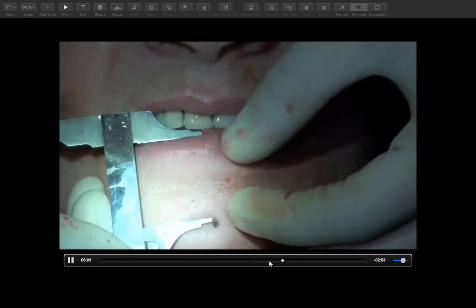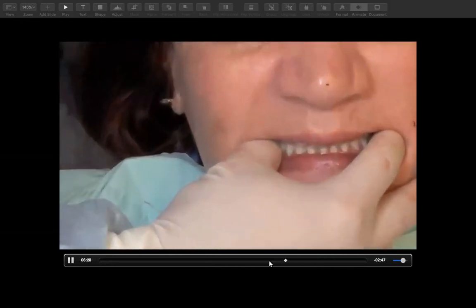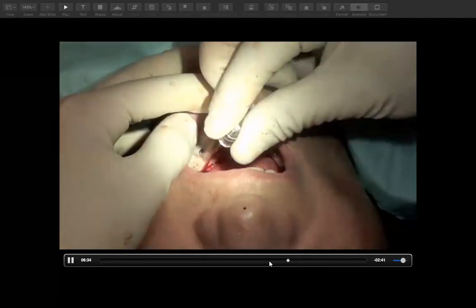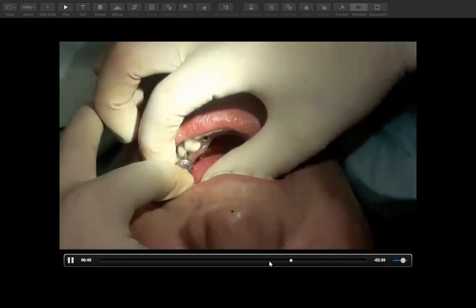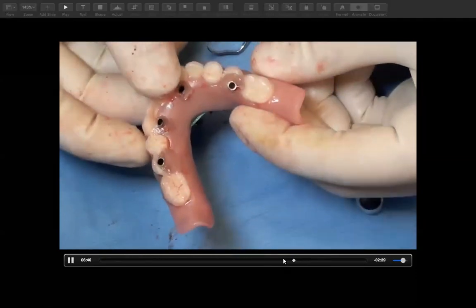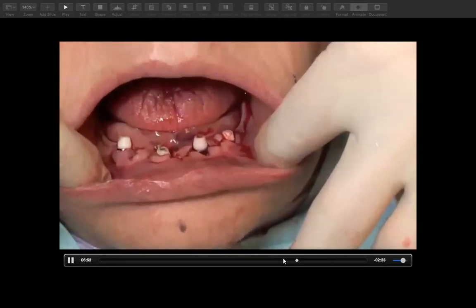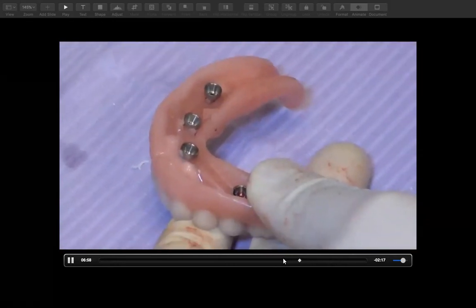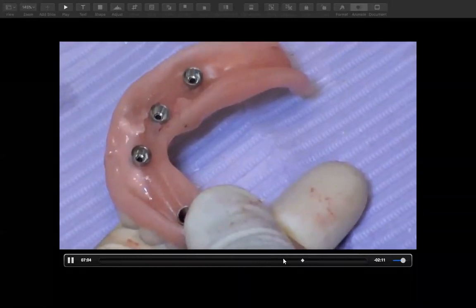So the material is now, the denture is now set with the material in there. It's almost like what you're doing is relining to compensate for the alveolar and for picking up the temporary copings. So once that material has set, we're going to go ahead and unscrew that, and then the actual conversion can be done. At this point, I like to make sure those temporary copings are solid before I take it back and make sure the screws are out. The doctor has the screws. For the conversion process, I don't need the screws, and then the temporary coping healing caps are put on during the conversion. At this point, this takes me probably 45 minutes to an hour to do the complete conversion.